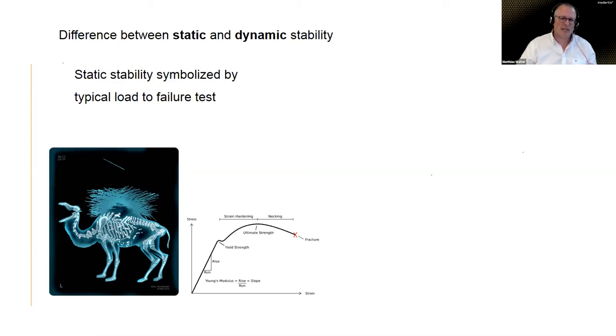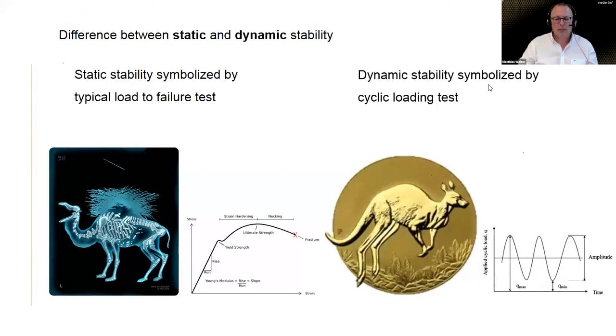Now, does this tell us anything about the behavior inside of a patient? Most possibly not. It will just tell us how strong the plate is. Is this important? To be honest with you, not really. That's why, to me, comparative tests where you compare competitor A, B, C, and D purely on strength of the metalwork do not tell me anything about clinical behavior. So that's irrelevant if you ask me. More importantly though, is what happens if you have a dynamic stability test.